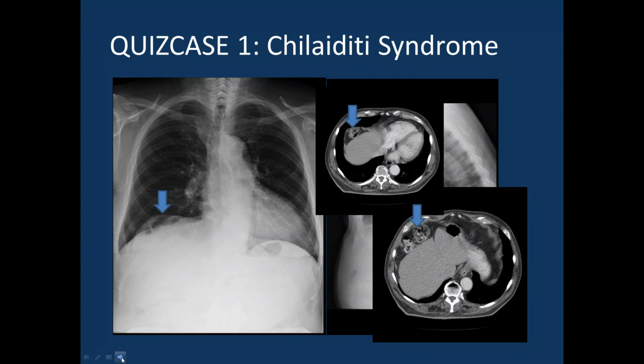And easy to detect, bubbles below the diaphragm. And you can have clinical symptoms, that's the reason why it's called Chilaiditi syndrome. So you can have obstruction or some pain in the right upper abdomen. 2 liters of Coca-Cola can make really problems to breathe. I imagine that.